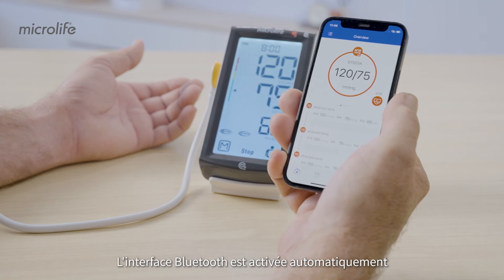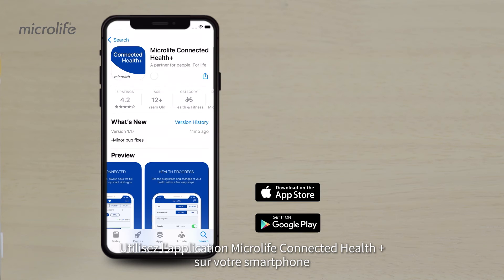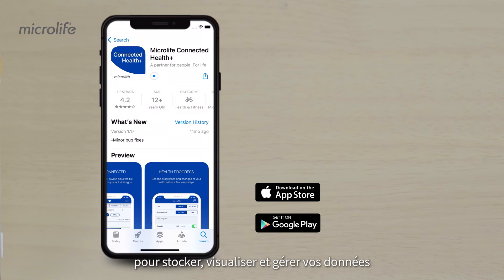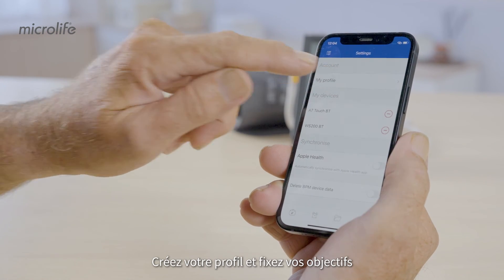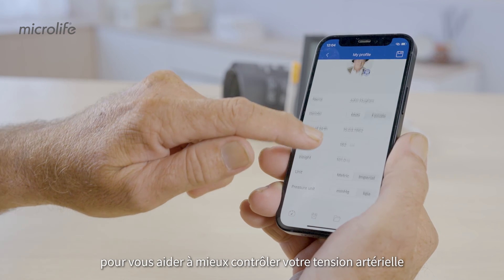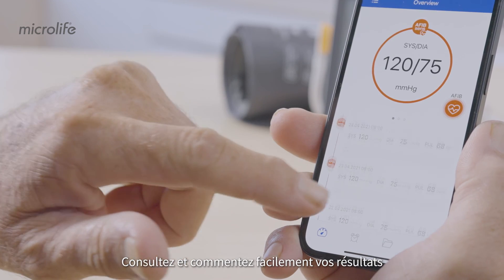Bluetooth activates automatically after a measurement for data transfer. Use the Microlife Connected Health Plus app on your smartphone to store, review, and manage your data. Set up your profile and use personalized targets and reminders to help you stay on top of your blood pressure. Review and comment on your readings easily.